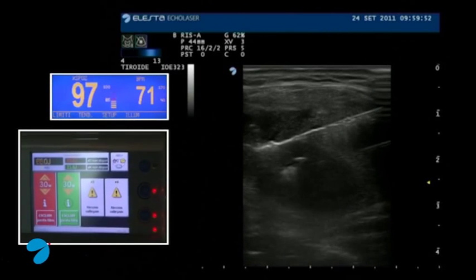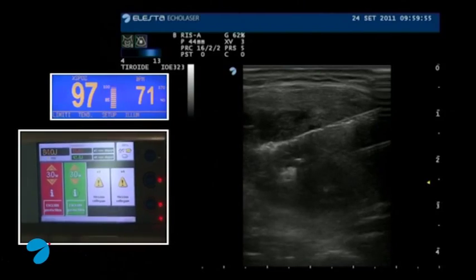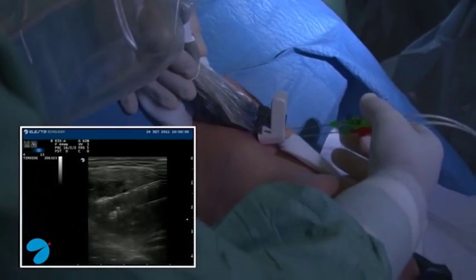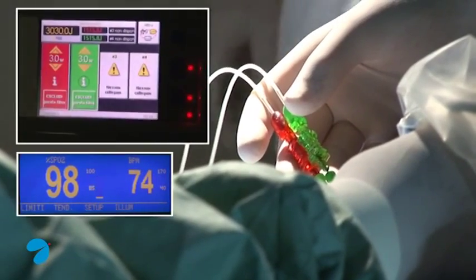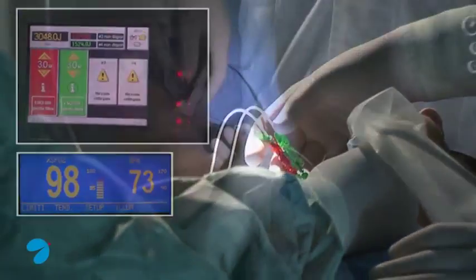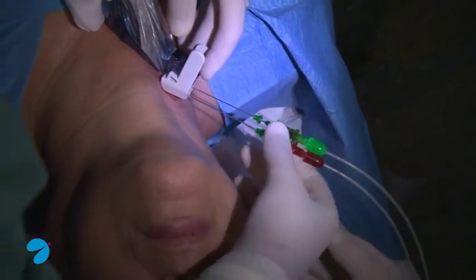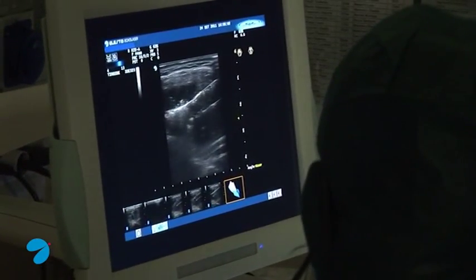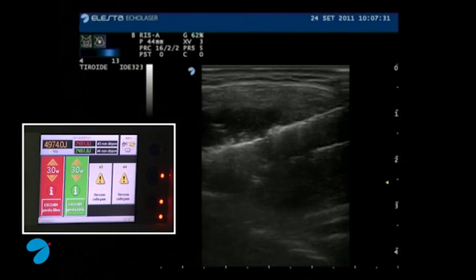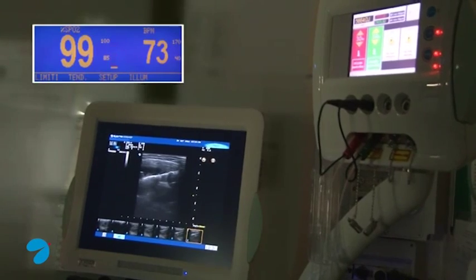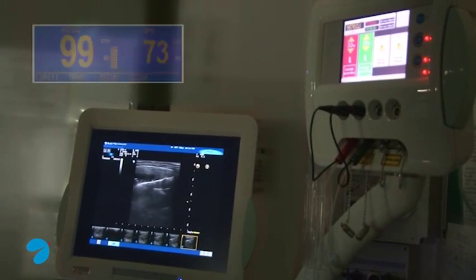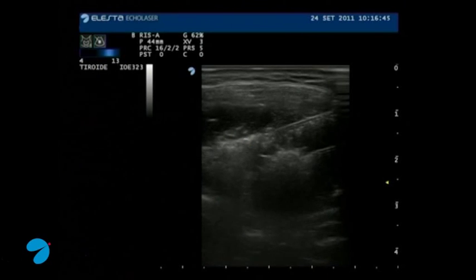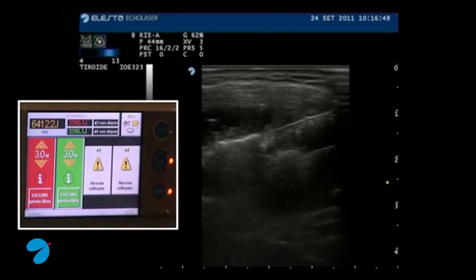The fibers are delivering energy into the nodule. We check vital parameters such as cardiac frequency and oxygen saturation, and we check the energy delivered for each fiber. After treating one portion of nodule tissue, we reposition the needles and fibers to perform a second treatment, increasing the volume of treated tissue inside the nodule. At the end of treatment, we verify the delivered energy per fiber.